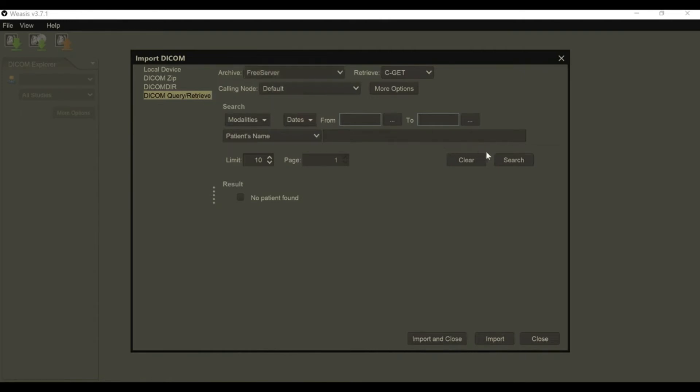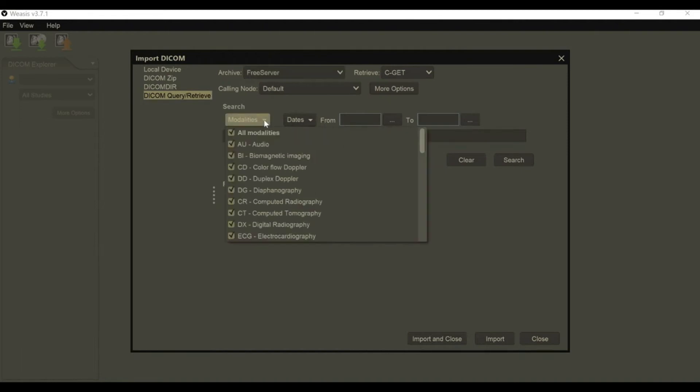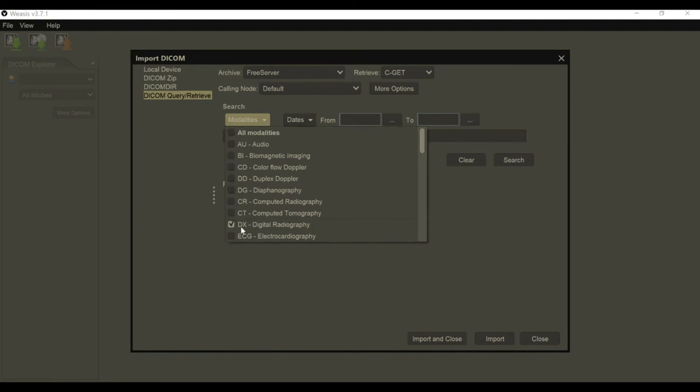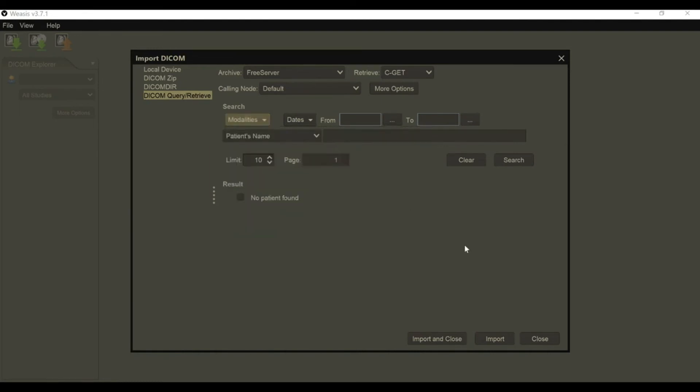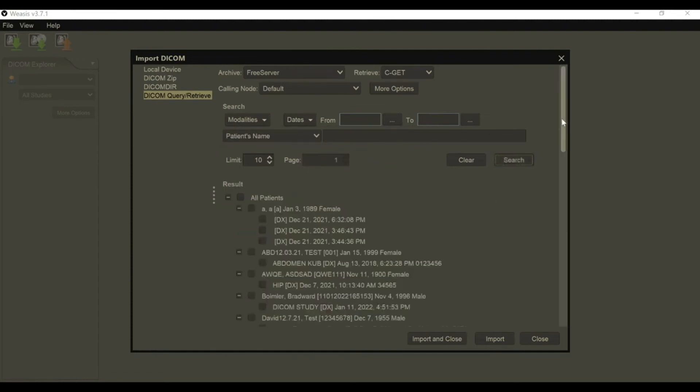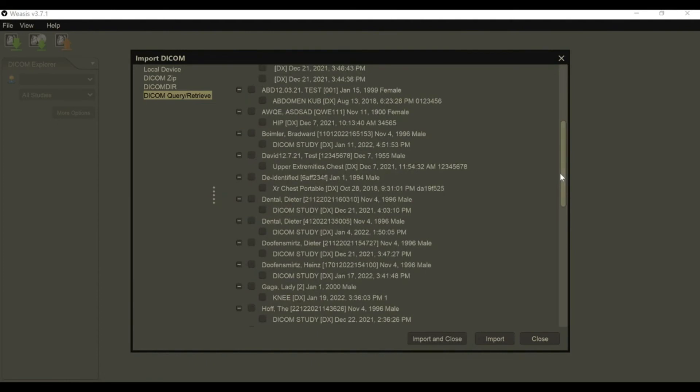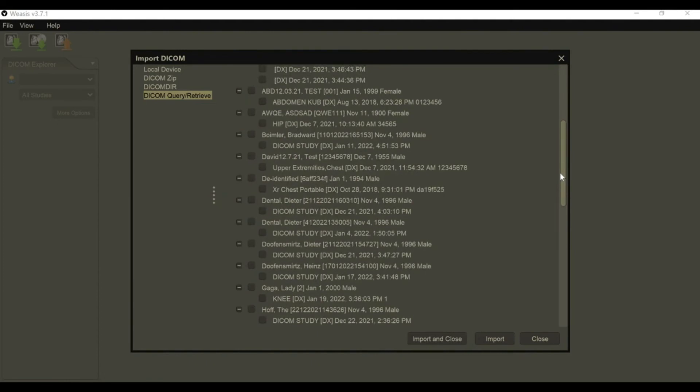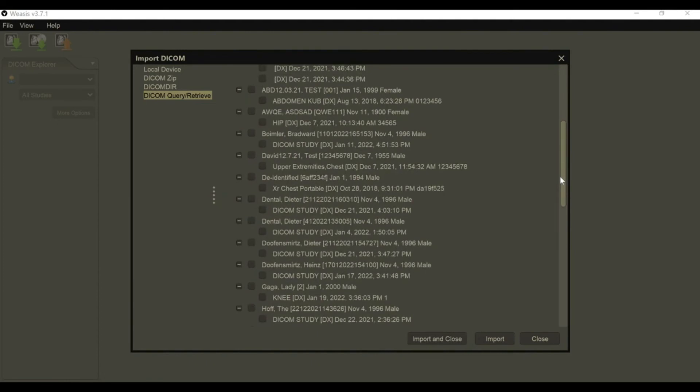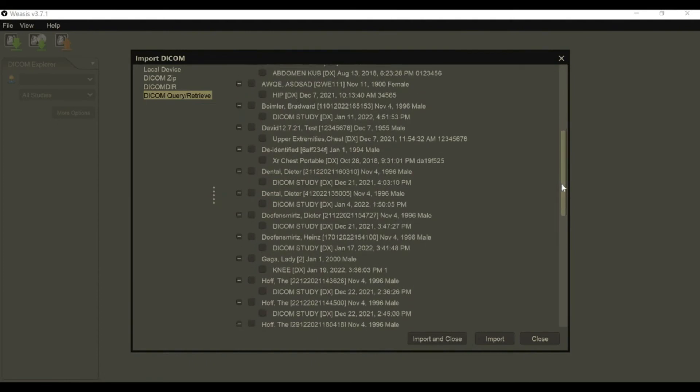We're going to choose the modality we're looking for. It defaults to all modalities here. You're going to narrow it down and select what you want. If we're looking for digital radiography, DX, let's search for that. Click search, and it's going to find all the studies on our server.